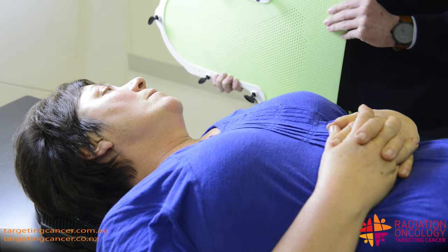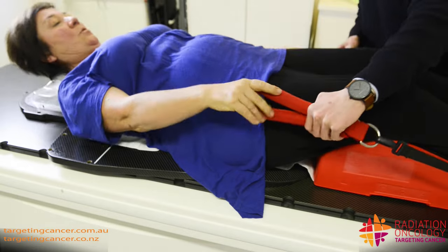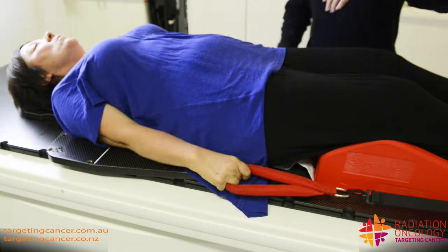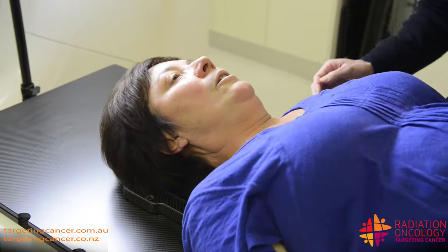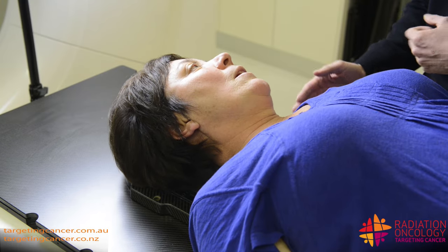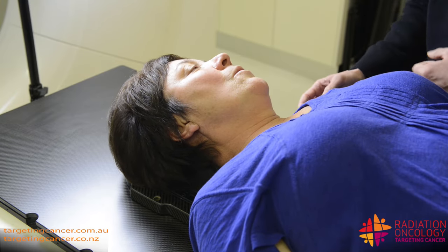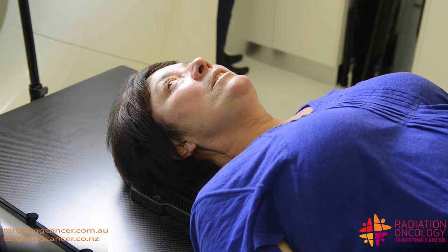It should only take about five to ten minutes. Okay Julie, so I've got these little shoulder retractors for you to hold onto. The idea behind that is to just bring these shoulders down, and what that's going to do is open up that neck. So when we do the treatment and the planning processes, it gets those shoulders out of the way and ready for treatment.